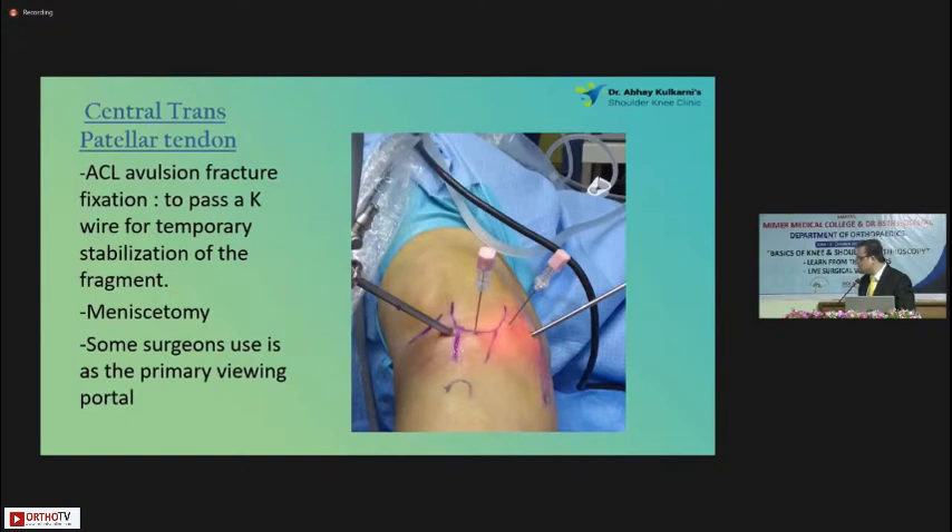This is the trans-patellar tendon portal, also known as the Gilquist portal. Some surgeons use that as a viewing portal also for ACLs — whenever they want to do anatomical ACLs, they use this portal many times.